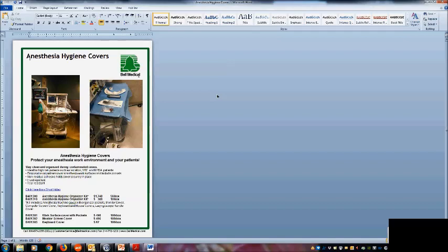And they basically started using it for their prion diseases. I don't know if you know prion diseases. It's a specific neurological disease that is also called mad cow disease. It is like Ebola: you cannot decontaminate anything. So all the surgical equipment that gets utilized for this case will be thrown out because you cannot sterilize this equipment. And they had a few cases, and they didn't know how to deal with the anesthesia machine because it's in patient secretion, this protein particle.